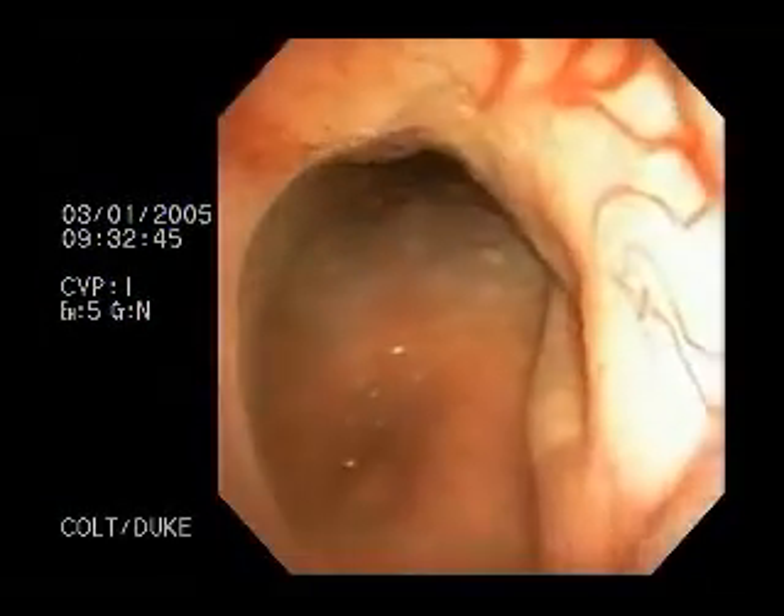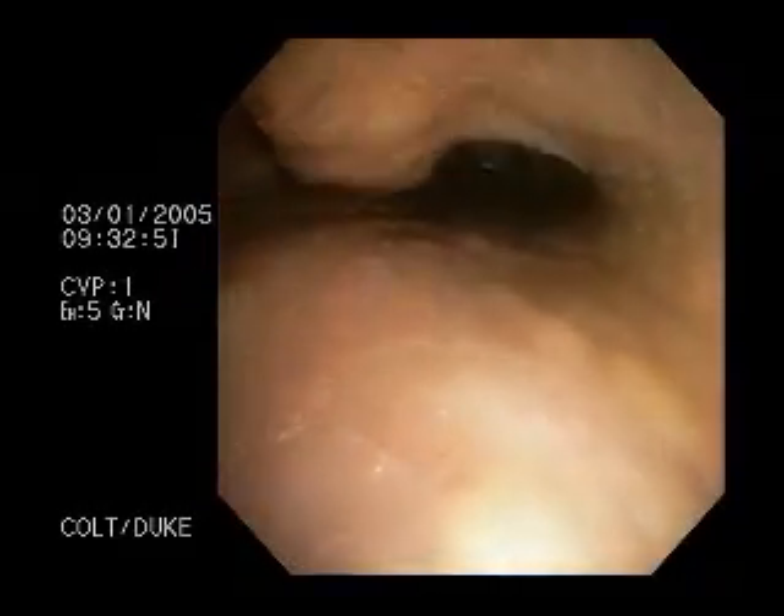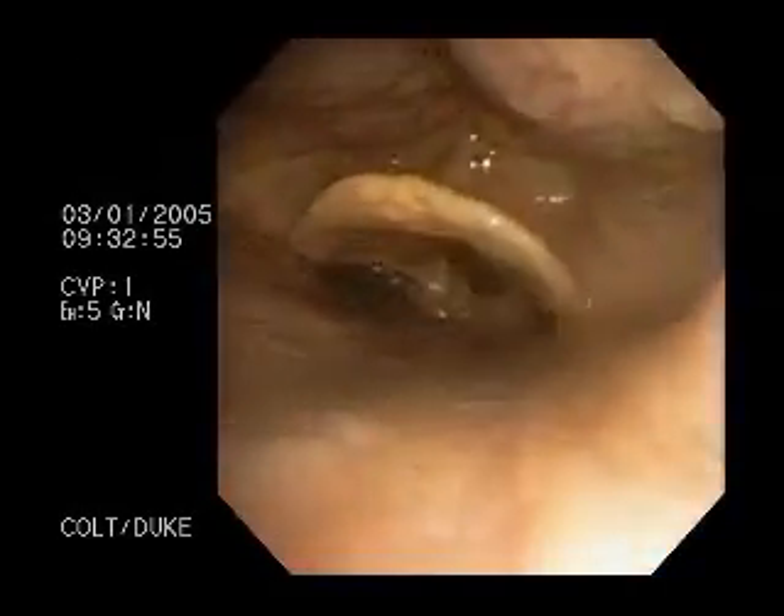From the head of the patient, the bronchoscope is advanced past the middle meatus. The uvula is seen anteriorly pointing towards the larynx. The epiglottis is seen anteriorly protecting the glottic aperture. The arytenoids are seen posteriorly at the six o'clock position.